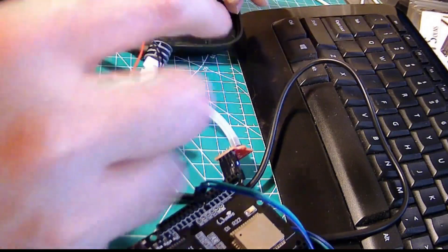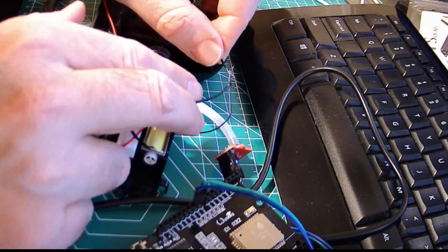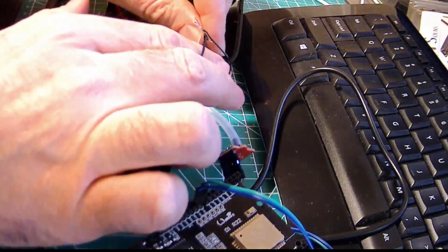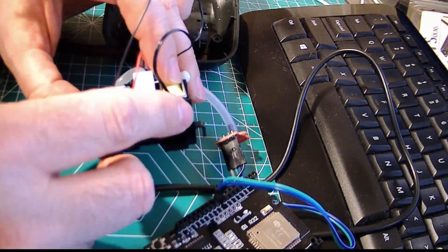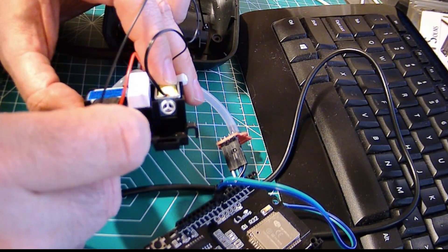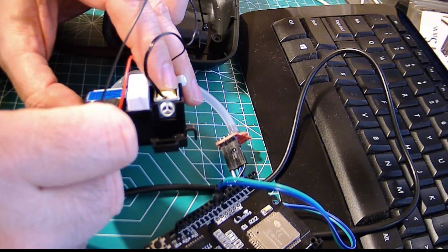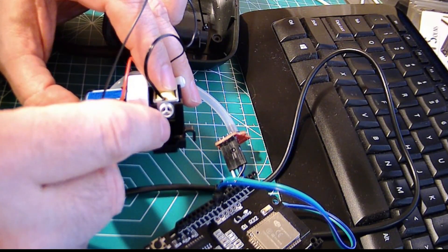I've got this little rig where I'm just applying power manually. I'm going to touch these and you might be able to hear it buzzing. That inflates the cuff, and when I depower it, the solenoid valve releases the air. It's actually a normally open valve — you have to energize it to keep it closed so the cuff pressurizes, and once you remove power, it releases.